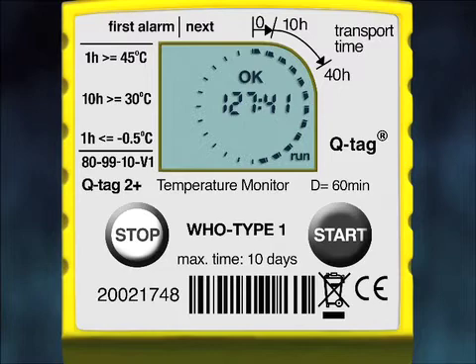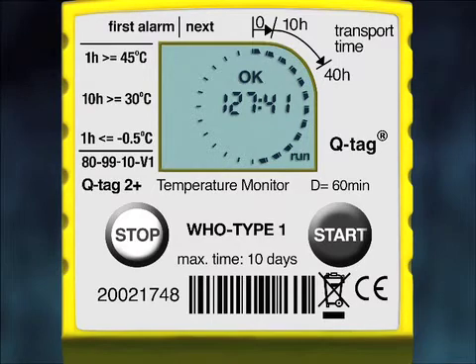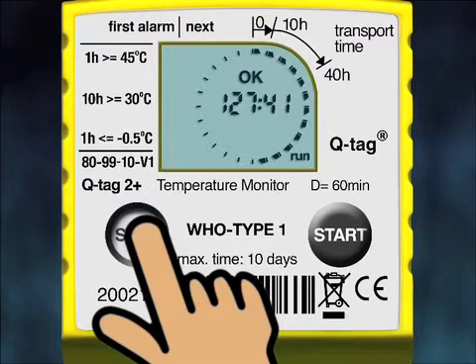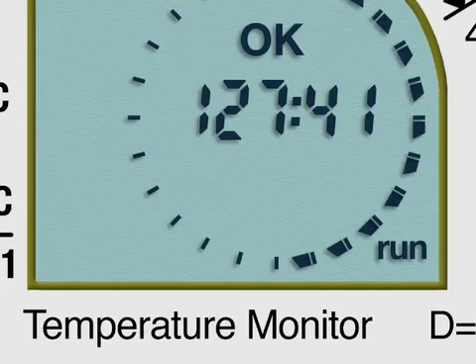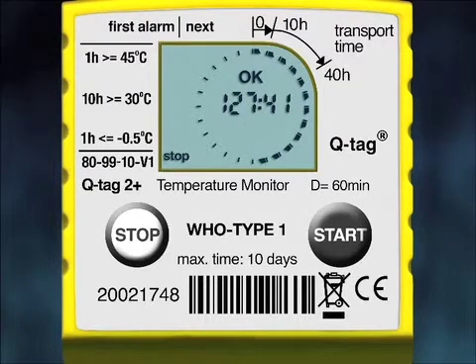When you receive an international vaccine shipment, you must open all the cartons one by one to remove the devices. When you remove the QTAG 2 Plus from the carton, you will see the run signal flashing on the bottom right corner of the screen, which means that the device is in active recording mode. In order to stop the device, you have to press the stop button for three seconds. The run sign will disappear from the bottom right corner and the stop sign will appear on the bottom left corner. The device is now stopped and will not record anymore.